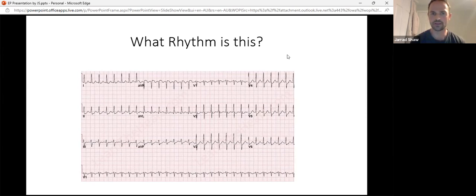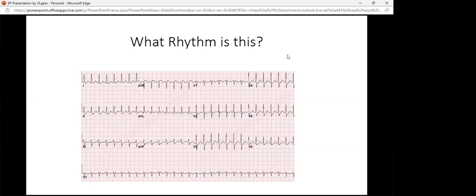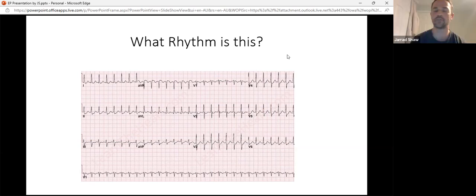If during that instance, like I said, we pick up another kind of tachycardia, it depends on where it is. The kit that we're currently using means we may or may not be able to treat it there and then, so we may bring the patient back anyway. But certainly it's all about treating your primary pathology first, and then worrying about anything else a little bit later on. And your second question was about the pacing, and that's very important.